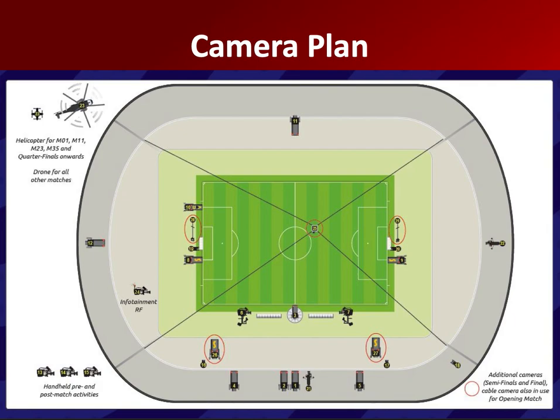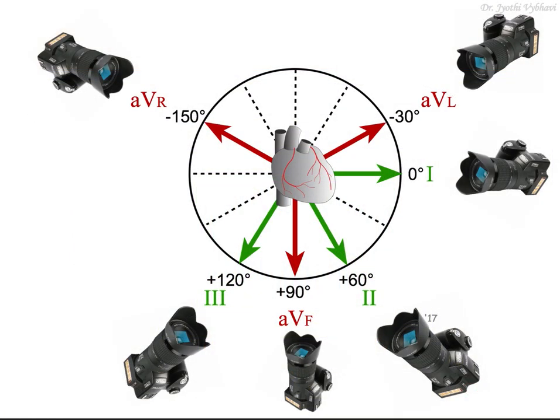So when I come to 12 lead ECGs, it is also doing the same thing. Taking an ECG is just like recording a football event, like a very big football match, with an array of different video cameras. Each lead records a different angle.